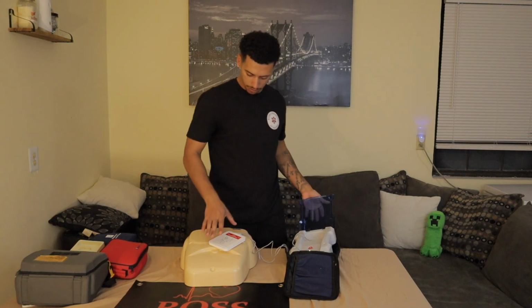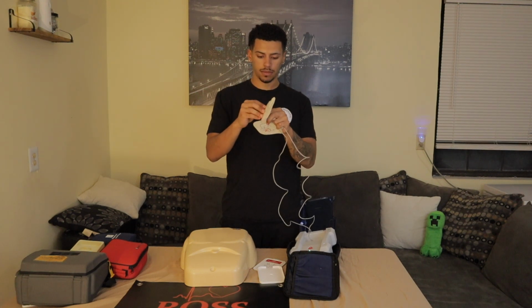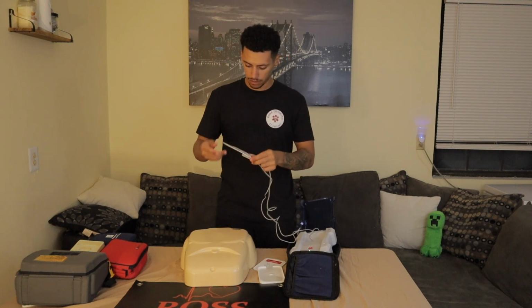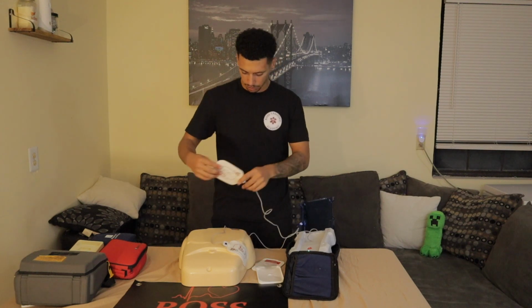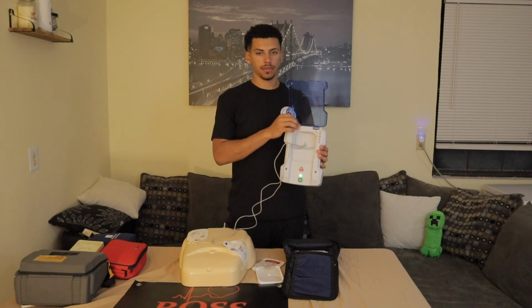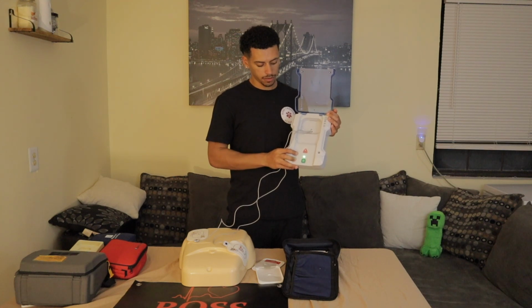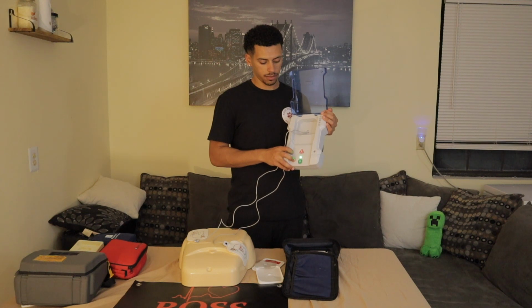Open packet and apply pads onto patient's bare skin. Apply pads as shown in the pictures. Open packet and apply pads onto patient's bare skin. Apply pads as shown in the pictures. Open packet and apply pads onto patient's bare skin. Press pads firmly on skin. Apply pads as shown in the pictures. Press pads firmly on skin. Do not touch the patient. Analyzing heart rhythm. Do not touch the patient. Analyzing heart rhythm. Shock advised. Do not touch the patient. Press the flashing shock button. Shock delivered. Begin CPR.